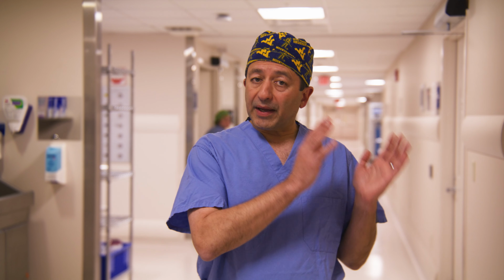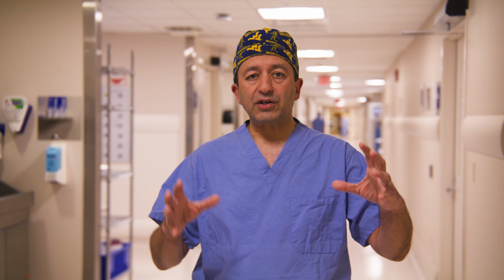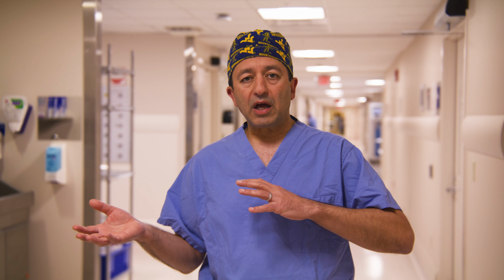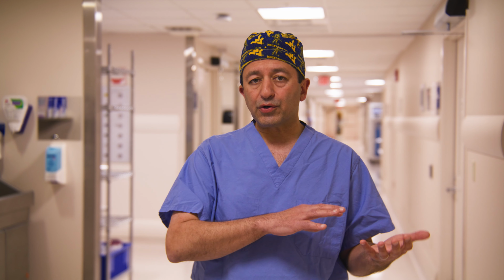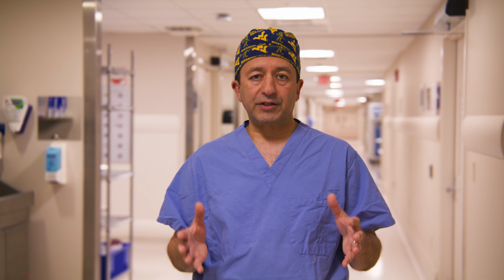So now we've seen how to perform robotic, mechanical, as well as bioprosthetic mitral valve replacement. Let's reflect for a moment on all that we've seen so far in this season. These are the fundamental building blocks to begin a robotic heart program, starting from exposure, cannulation, preparation, docking, left atrial opening, left atrial closure, myxoma resection, fundamental mitral valve repair, and replacement.